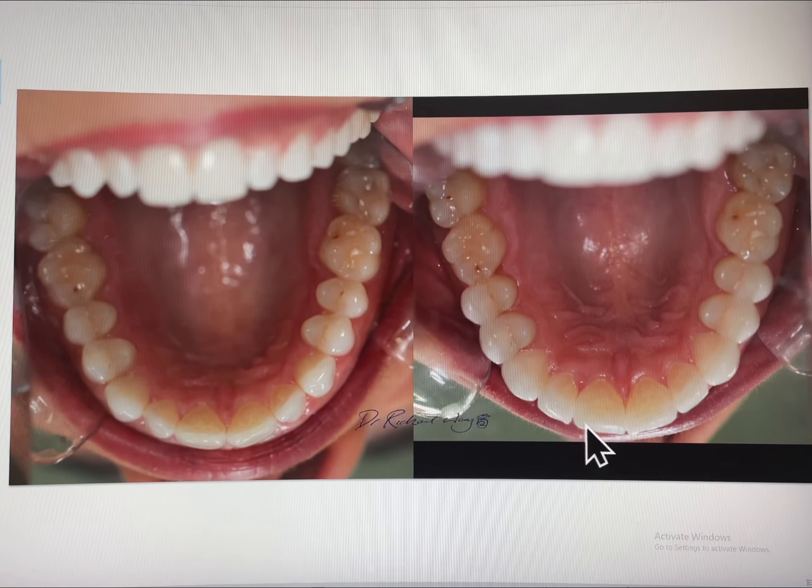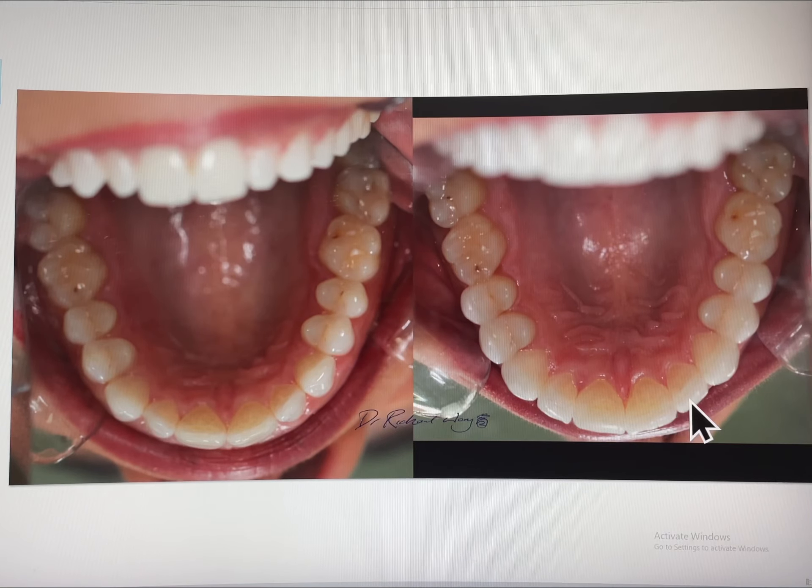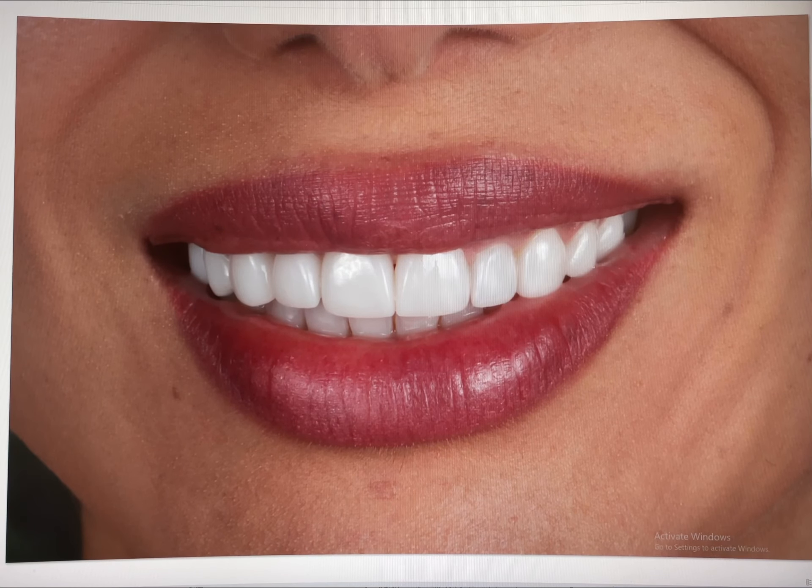Here we can see the super thin veneers perfectly bonded onto each tooth, and here is the result — another happy patient smiling all the way to Brazil.